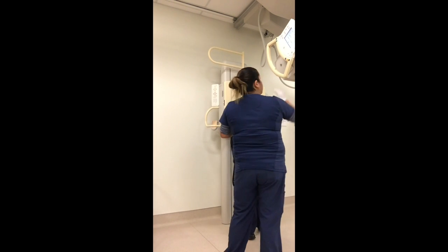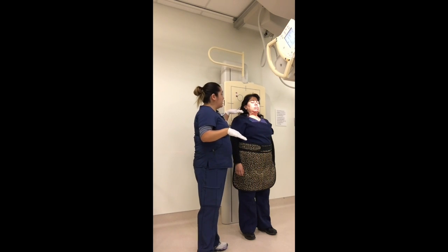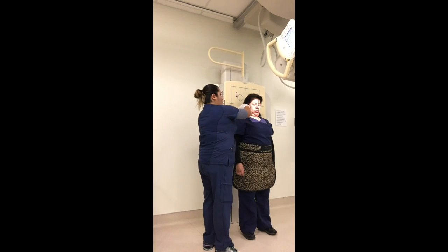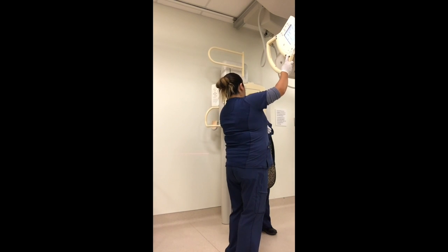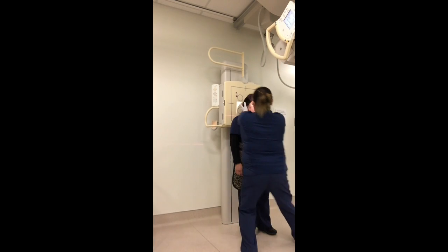And my patient's mid-sagittal plane is perpendicular to the IR, and I'm going to tilt her head. I want my patient's OML perpendicular to the IR. And my central ray is going to be 2.5 inches above the glabella.